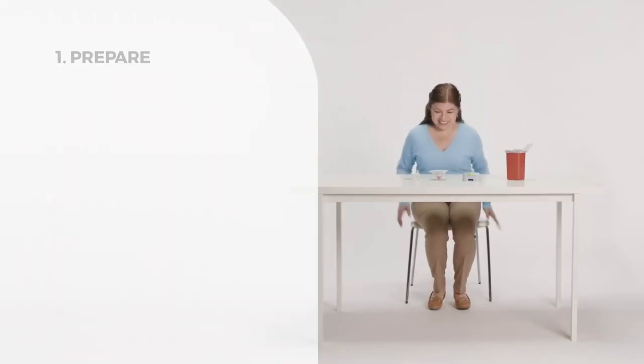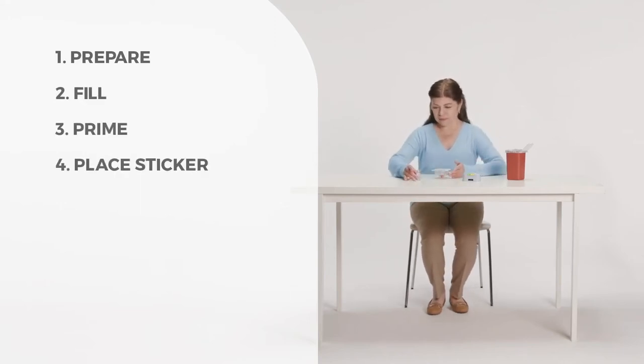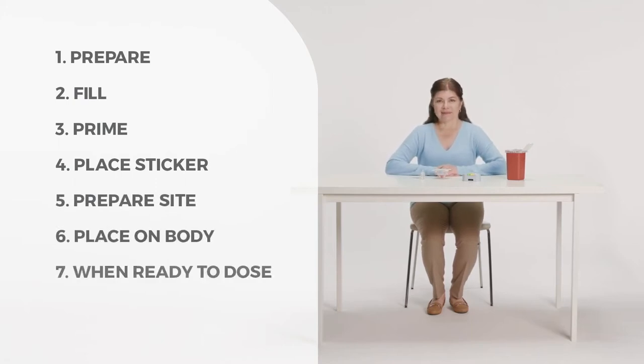This is Sandy. She will show you how to prepare your supplies, fill and prime your patch, place the change-by sticker on your patch, prepare your application site, place the patch on your body, and finally, dosing and safety features of the patch.